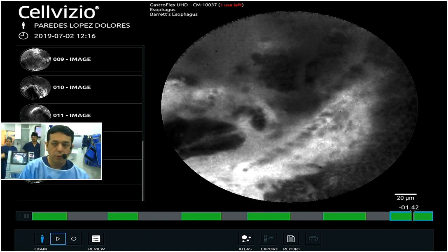So maybe some of you have a question regarding why you would do the resection just with optical magnification. The accuracy for dysplasia is high, with good sensitivity and positive predictive value, but that is not the situation here. It's because this patient already has histopathology confirming that this is a dysplasia. So if I confirm with my confocal, I will do my treatment.